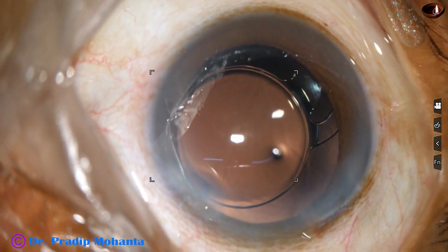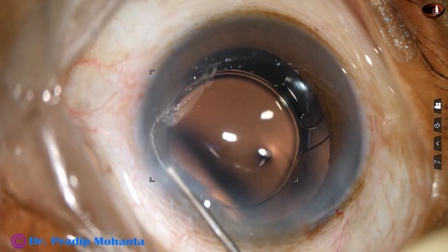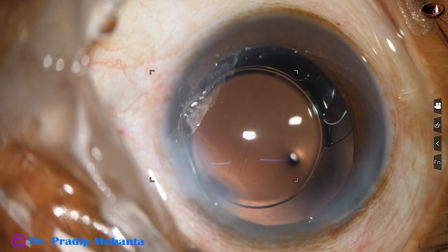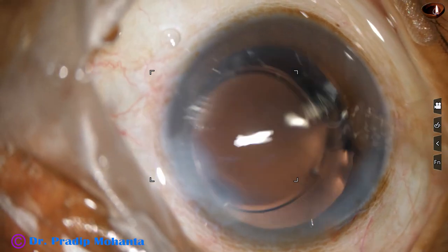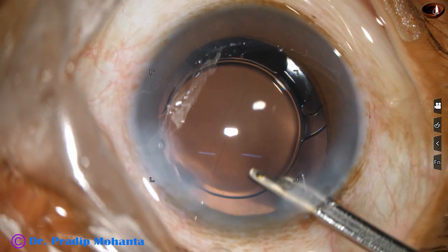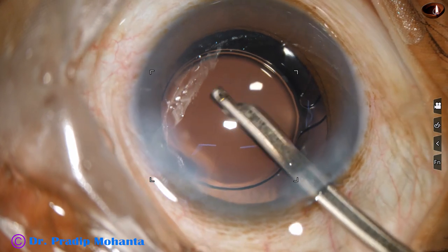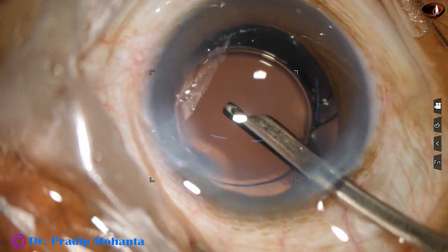This is a bit of moxifloxacin. And now the side port is closed nicely. The corneal stroma is hydrated and the side port closes. The main wound doesn't require any hydration. It will be self-sealed. This is the final lavage of the anterior chamber. And then the anterior chamber is formed very nicely in this way.